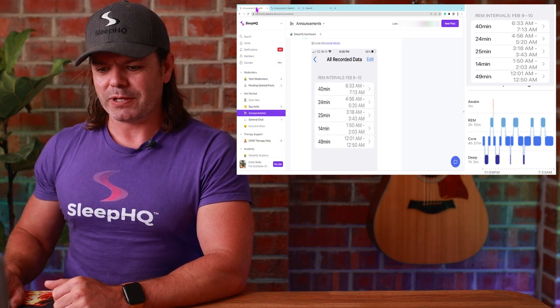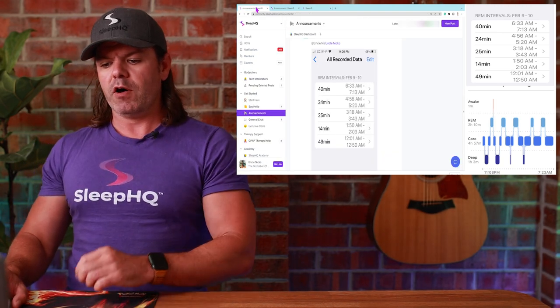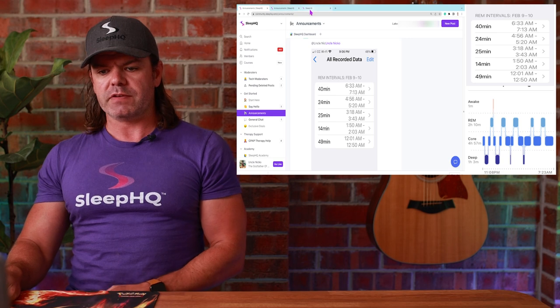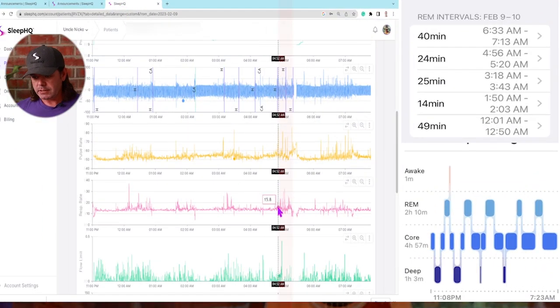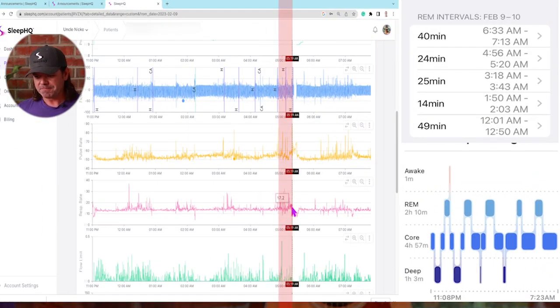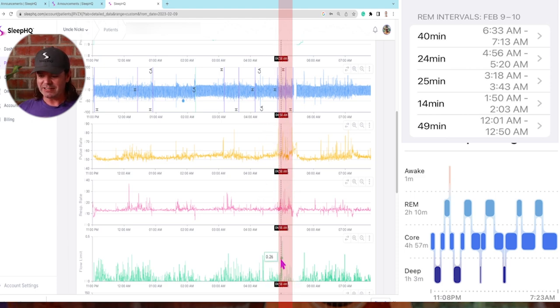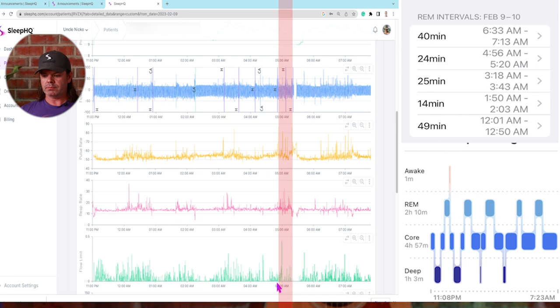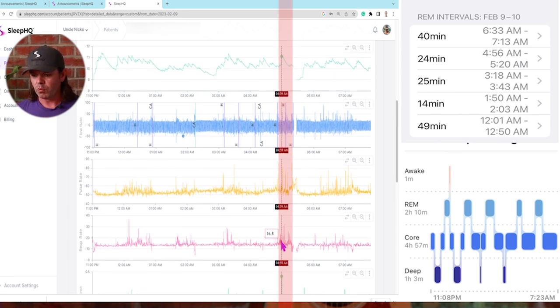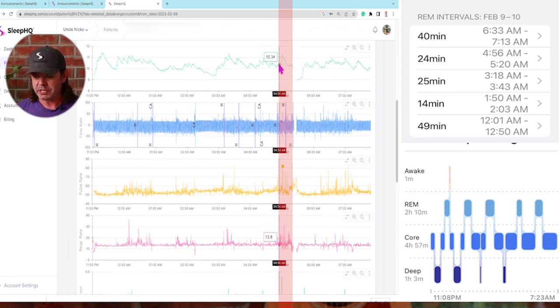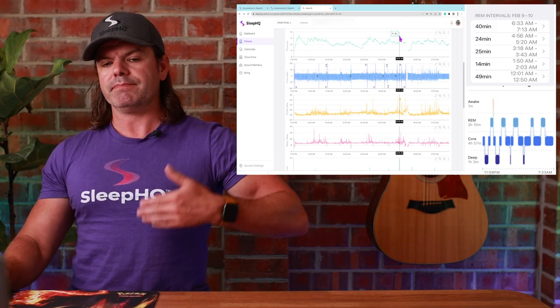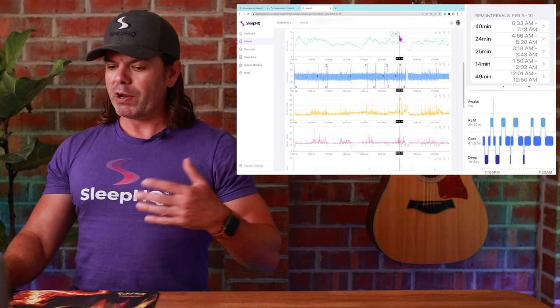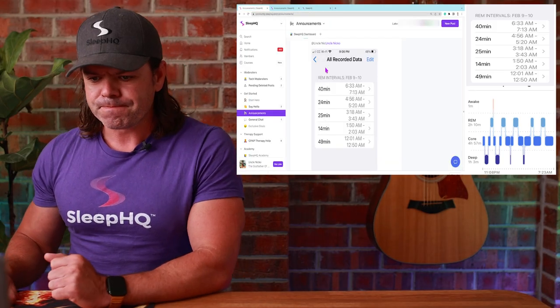Let's check the last one, second last one. 24 minutes, 4:56 to 5:20. So here it is, 4:56 to 5:20. Once again, you can see it, guys. Look at the flow limitation. Boom! Big spike there. Look at that big spike in the flow limitation. What do the pressure do? Here's the pressure. Big jump up in pressure, see? The REM cycle. The REM cycle.